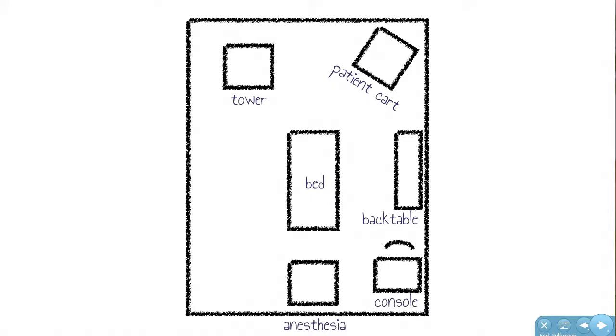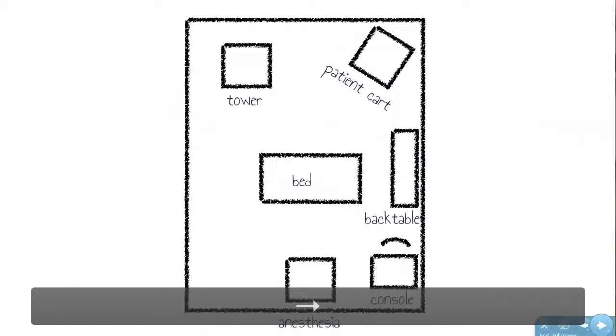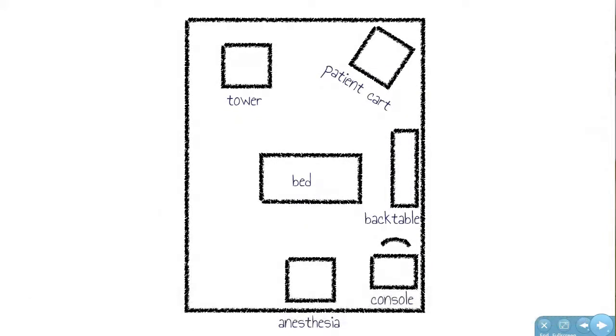This is how people are going to know where things are. It's how they're going to function comfortably in their environment. You say, well, this is fine for side docking, but what about for a prostate? These beds are on wheels, so unlock the bed, rotate it, and have the bed face this way. For a kidney, fine, rotate the bed all the way if you need to. It doesn't matter. The bed is the only thing that should move. If you can standardize, you can reduce the variability in the layout of your room, it will significantly improve your people's ability to function within it.